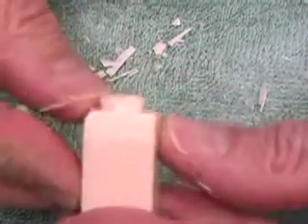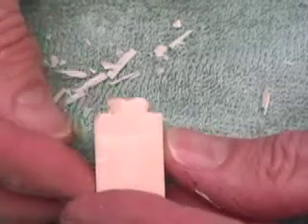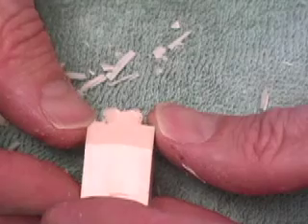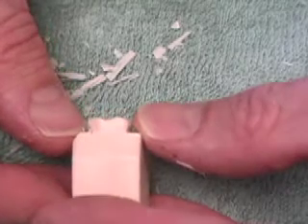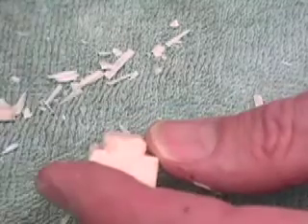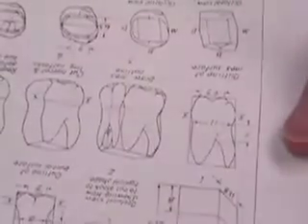So there's our first cuts from the facial view. That's about as far as we want to go from a facial view. Okay, we're now going to do a mesial view of this tooth.